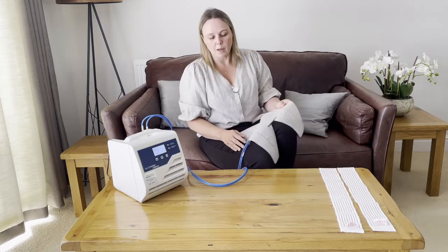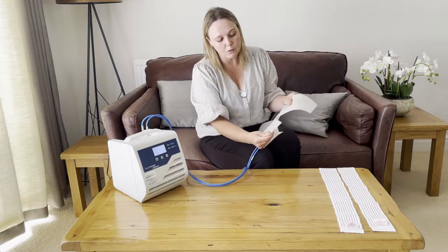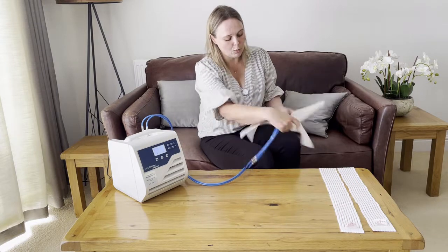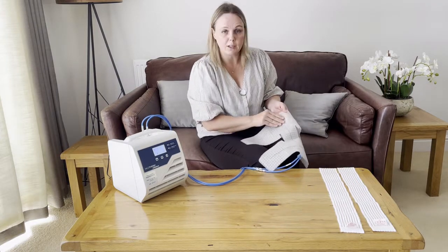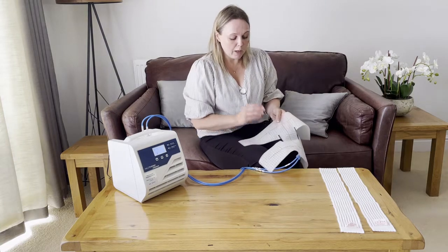The first thing you want to do before you've started the water flow is feel that one side is smoother than the other. You want to have the smooth side going down towards the patient.